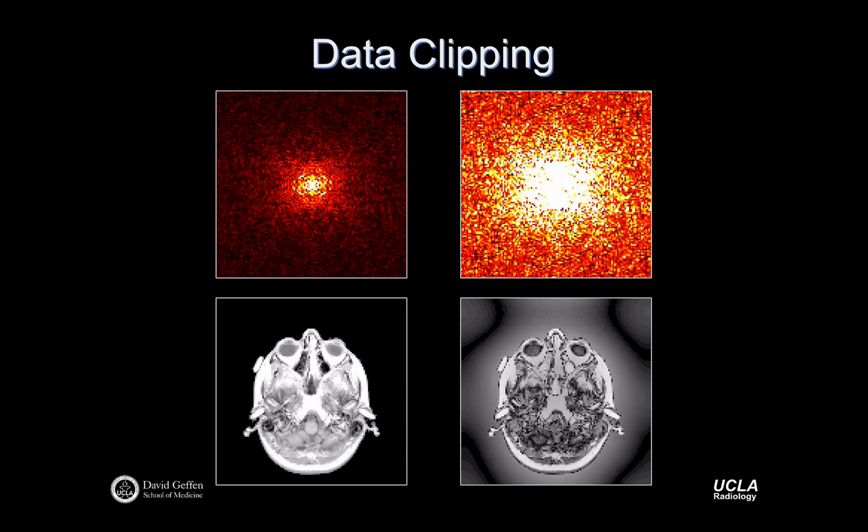But it's another example of, were you to ever see an image like this, it's helpful to think back to how that could possibly happen in K-space. You should begin already to have some ideas. When you see an image and you see an artifact, how does that connect back to K-space? One of the other obvious examples we've given is point or spike artifacts. This is, in some ways, related, but quite a different artifact. It's just called data clipping.